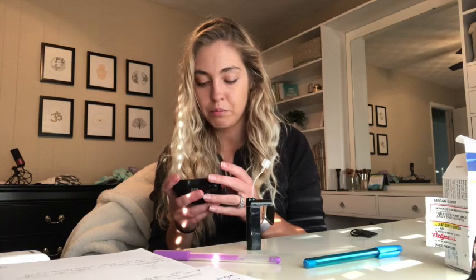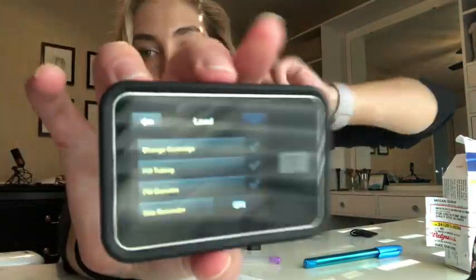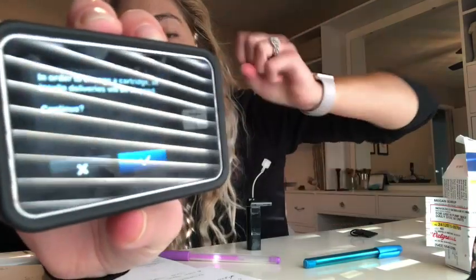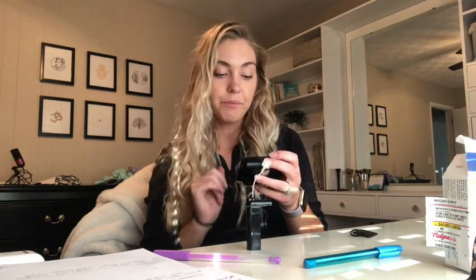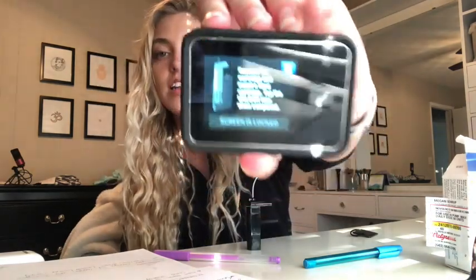Okay, so after that, I'm going to go to my pump, unlock it, and I'm going to go to load. And then this screen comes up and I'm going to hit the first one, change cartridge. Okay, so then it says in order to change cartridge, all insulin will be stopped, and I say okay. And then it says make sure your infusion set is disconnected from my body. So I accidentally just ripped mine out, so mine is disconnected. And then it says preparing for a cartridge and then install cartridge and unlock once you've done that.